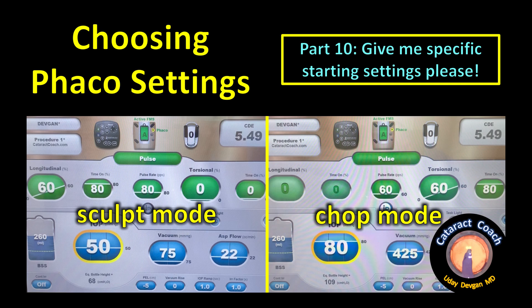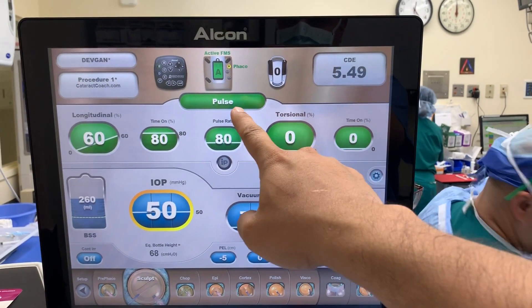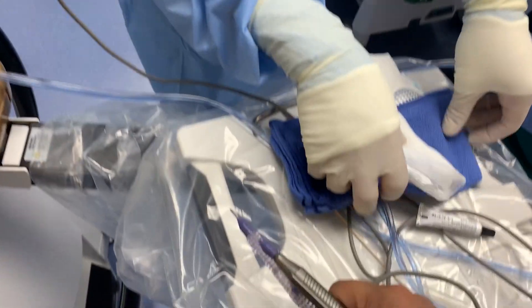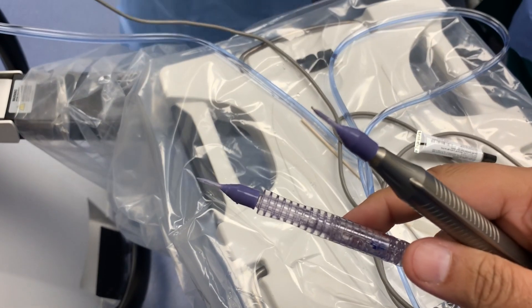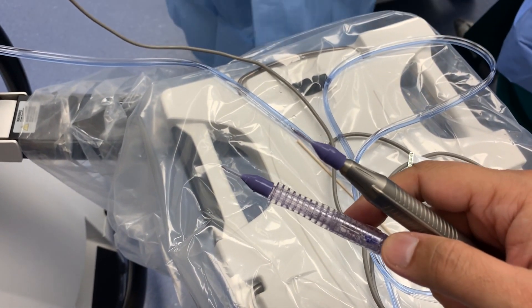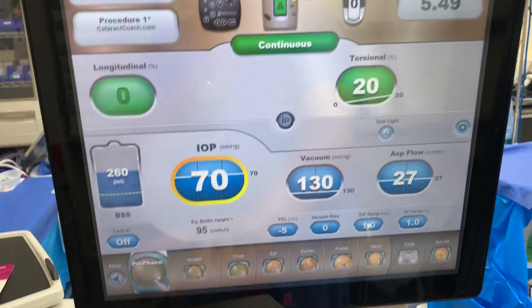Give me specific starting settings, please. Before we get into any of the programming of the energy, which is in green, and the fluidics in blue, look down here. We need to know what's the specific FACO needle — 20 gauge here — and what's the sleeve size, 2.75. Those will both affect the fluidic flow, so you must make adjustments accordingly.